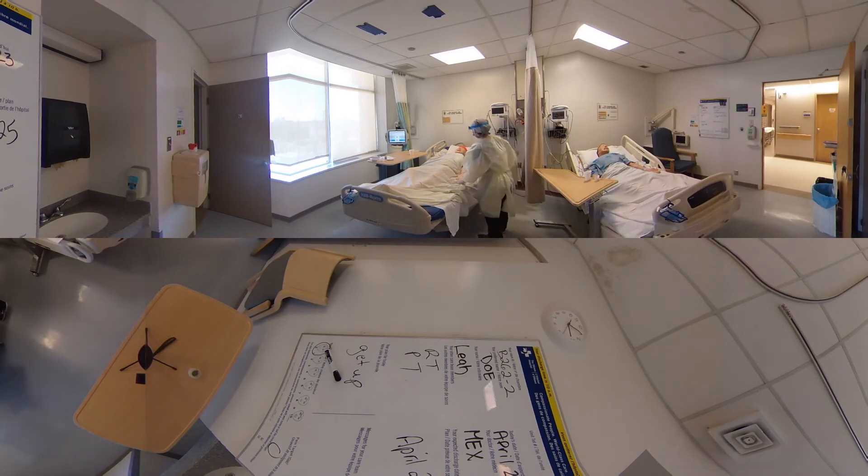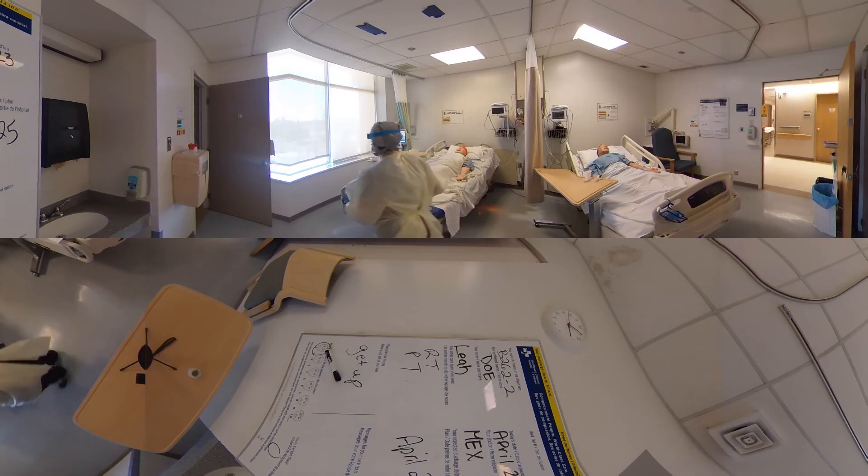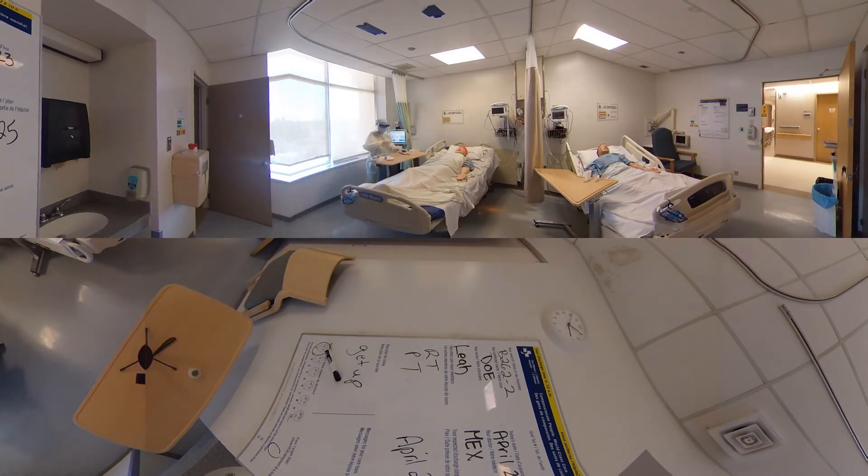Good morning, Mrs. Doe, how are you today? My name's Leah and I'm going to be your nurse today. I've brought in some medication for you. Would you mind if I just checked your bracelet quickly? Can you tell me your name and date of birth? Mrs. Doe, September 10, 1942. Perfect. I have some medication for pain here — Tylenol and ibuprofen. I'm just going to scan your bracelet. These meds are ready for you to take. Awesome. And now I can hit accept on my medication administration.